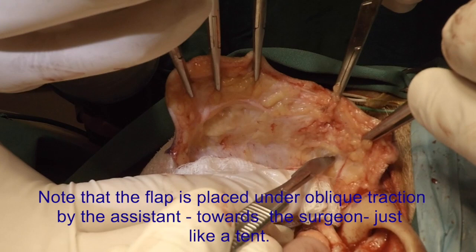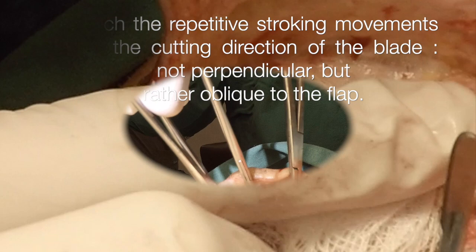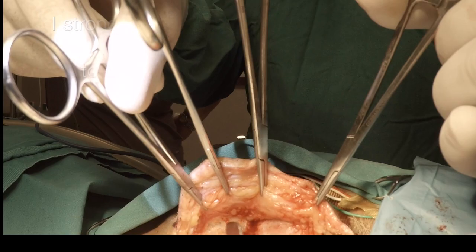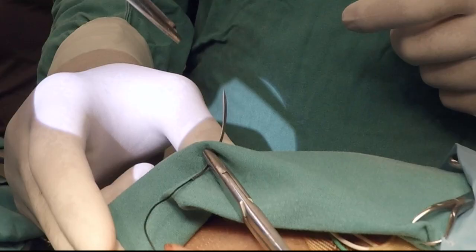Watch the repetitive stroking movements and the cutting direction of the blade, not perpendicular, but rather oblique to the flap. I strongly recommend this step, as well as the whole operation, to be done under 3x magnification. I fasten the flap to the drapes with number 1 silk sutures.